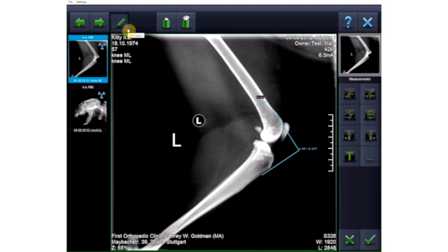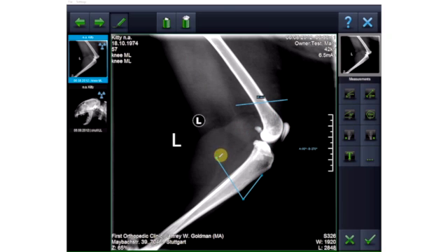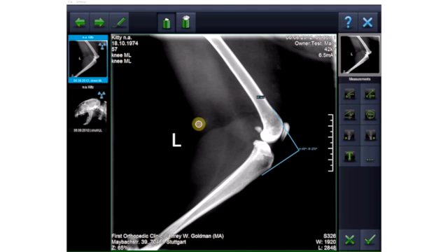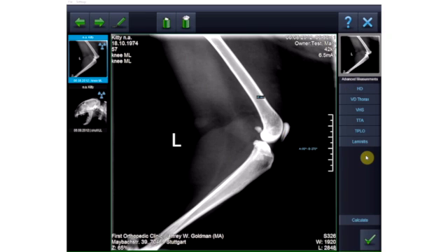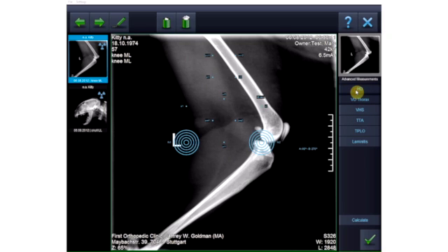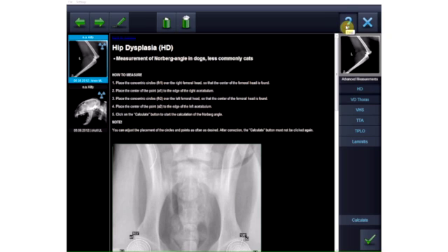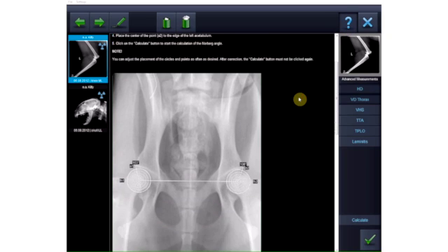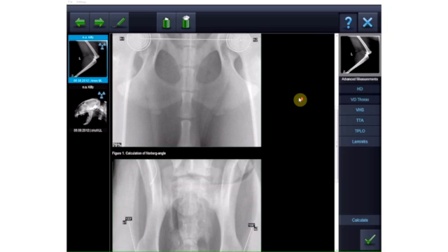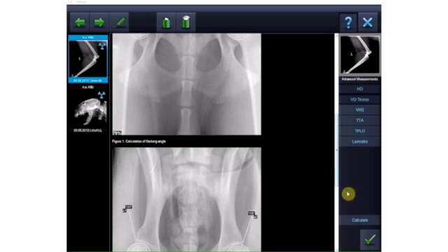All measurements and objects can be edited, that is, moved or deleted. Online help is also provided for the special measurement functions, such as measuring hip dysplasia in dogs, laminitis in horses, and VHS or VD thorax in determining heart size.